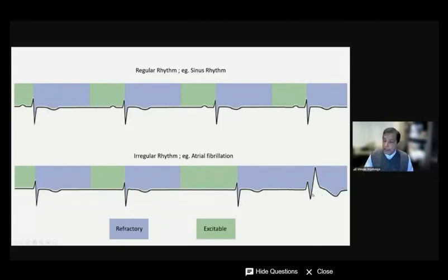And in that instance, since you're in AFib, there is no regularity. If a beat managed to go to the ventricle, it might fall into the refractory period of the right bundle, and you can get the right bundle branch block aberration, just the same way I described earlier. And this was described in 1947 by some group of people who noticed this, and that's called Ashman phenomenon. So Ashman phenomenon means in atrial fibrillation, when you have a long interval, it can be followed by a wide QRS complex, but the wide QRS complex is just because the right bundle is refractory.